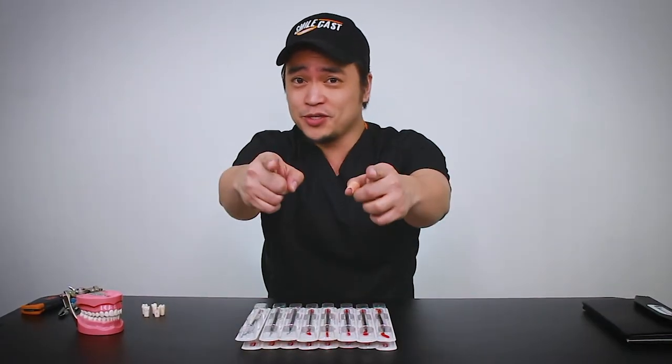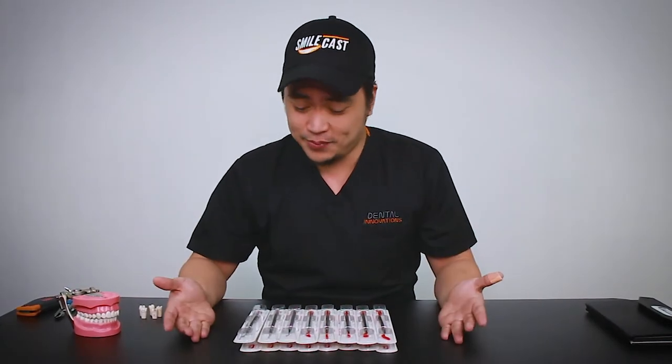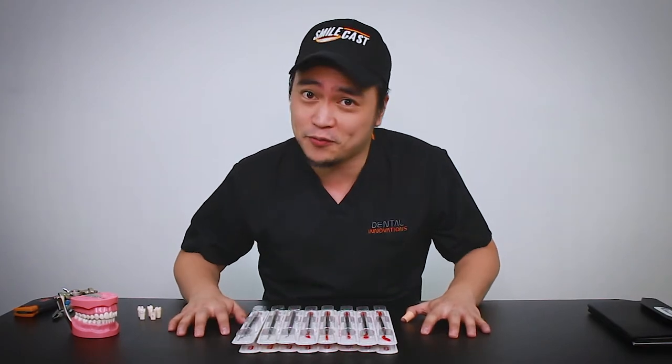Dentistry involves a lot of instruments. If you're a dental student, you know that. Take a look at my table here — this is just a small part of what we need.